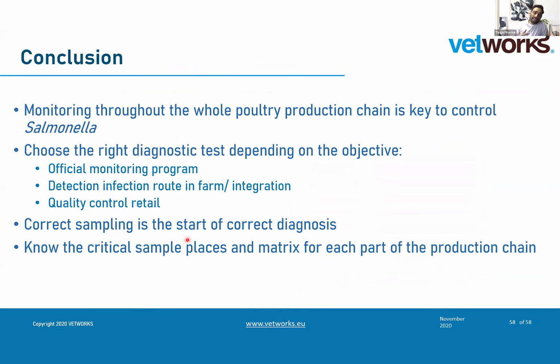So the important thing that I wanted you to take away from this presentation is that monitoring through the whole chain is key to control Salmonella. The diagnostic tests that we use should be adapted depending on our objective: if we are doing an official monitoring program, a routine check on the farm, or a quality control at retail, at the final level.